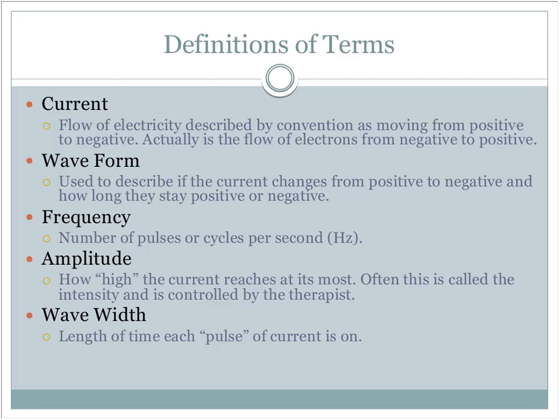As the wave rises, think about a horizontal line, and then the wave coming up above that line, moving into a positive polarity, reaching a crest, coming back down, maybe crossing that horizontal line, so going underneath it and developing more of a negative charge, and then returning back up to that horizontal line.